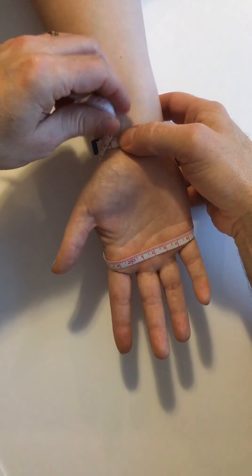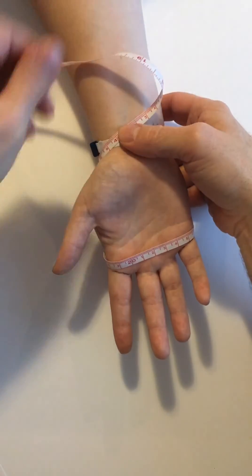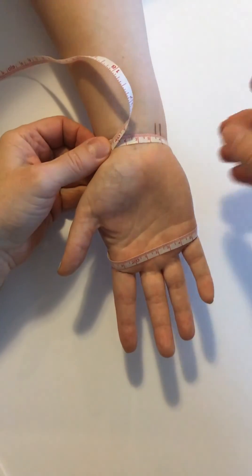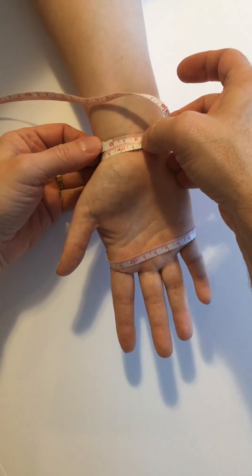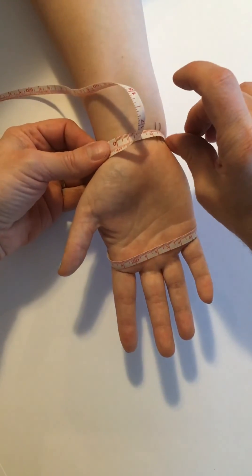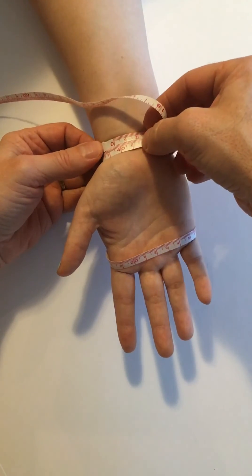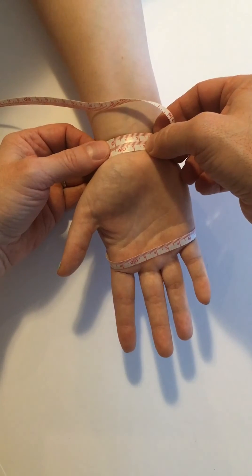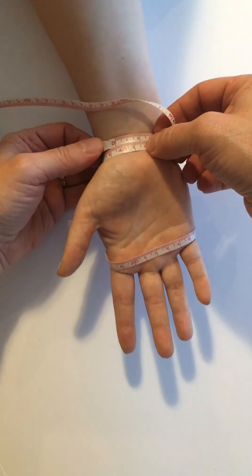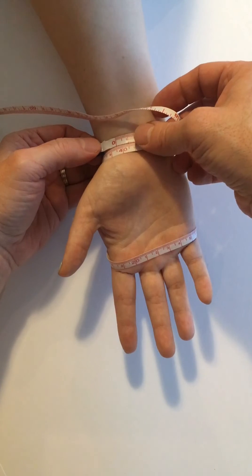Once we're there we'll line our tape up with our zero point where we started and once we've done that you just hold it snug. You don't have to pull it really tight, you don't want to squeeze any volume out of the hand because that will alter your measurement.